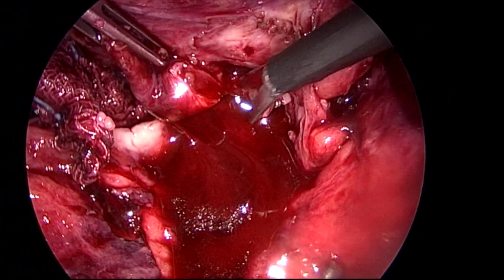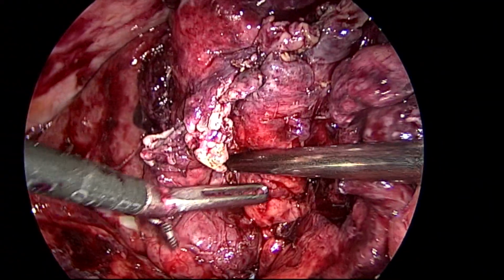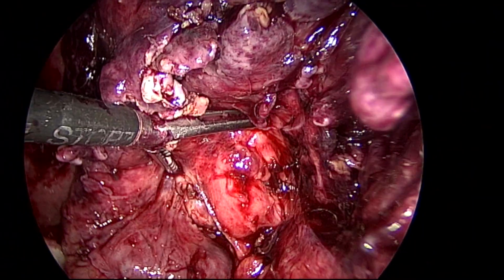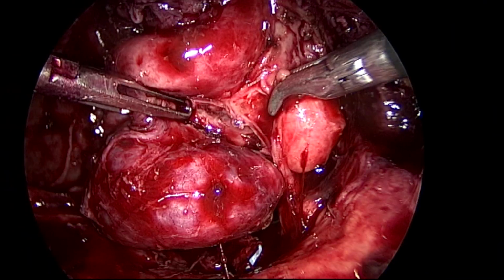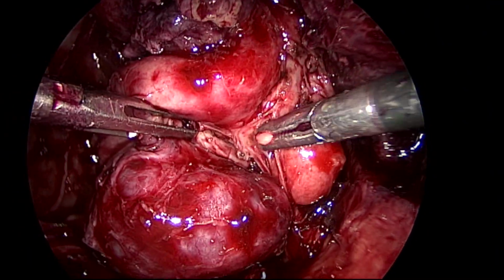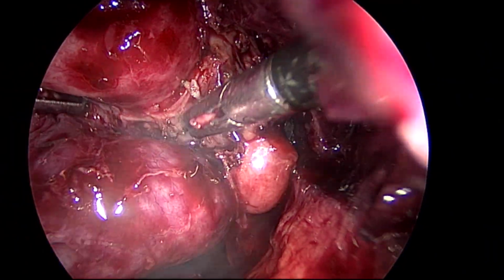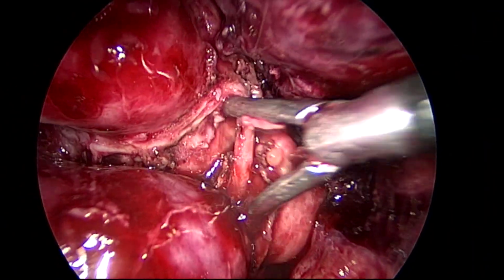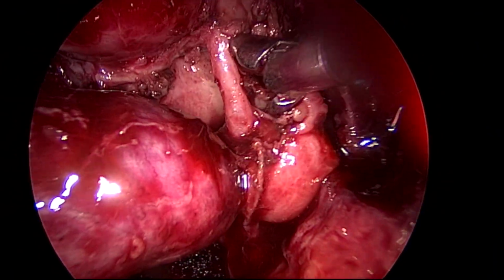Once I divide this, I can go up, go medially. Then I can see the cystic artery. Once I divide the cystic artery, only then the separation of the gallbladder. So now I am going up, to the medial side. If you see the node, you can be happy, because the node is usually present above the level of the cystic artery. So if you see the node, just below the node, the cystic artery will be there. In this case also, below the node I could see the cystic artery. I am separating the cystic artery. See, that is the cystic artery. I am clipping the cystic artery.